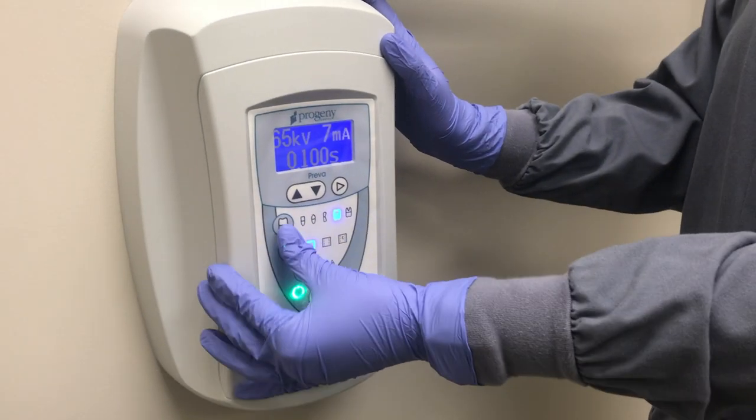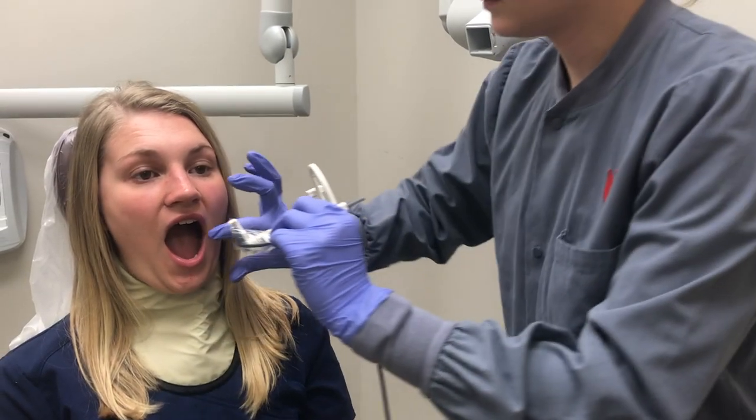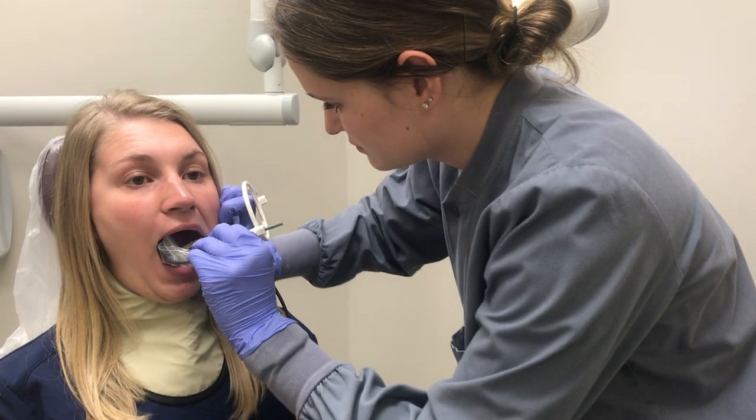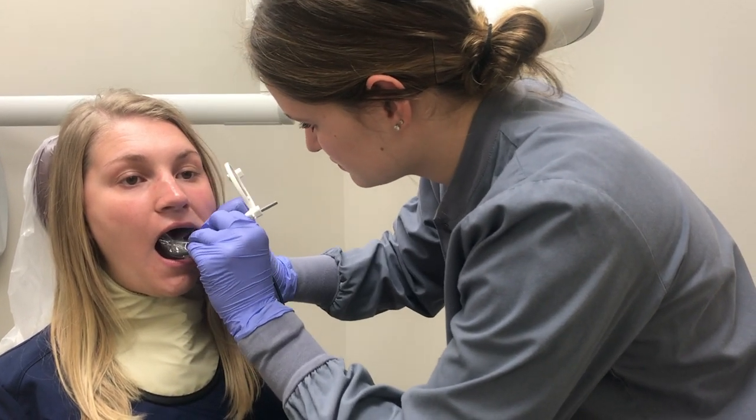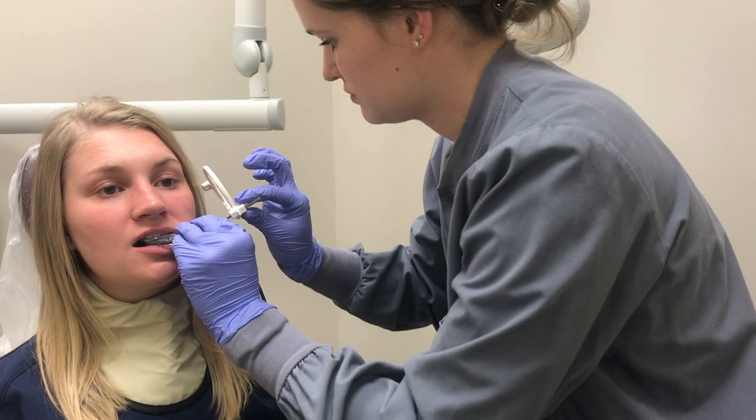On the control panel, select the molar and adult setting. Position the device in the oral cavity. Make sure the sensor is parallel to the long axis of the tooth and have the patient bite down slowly, ensuring that they bite down all the way.